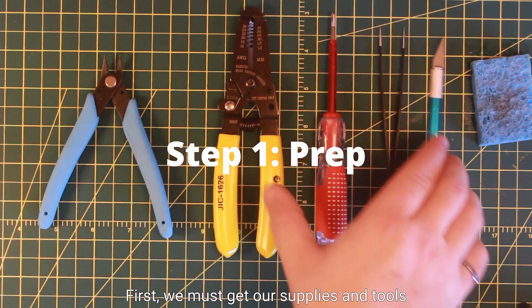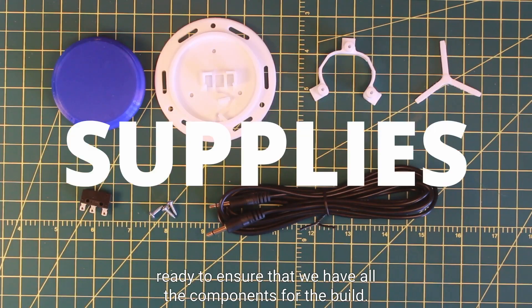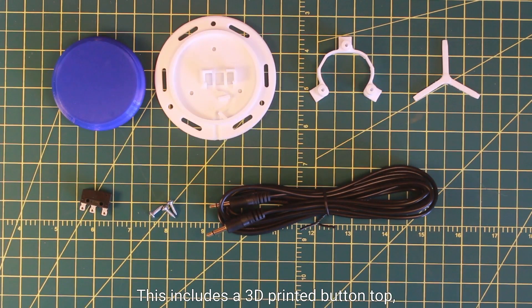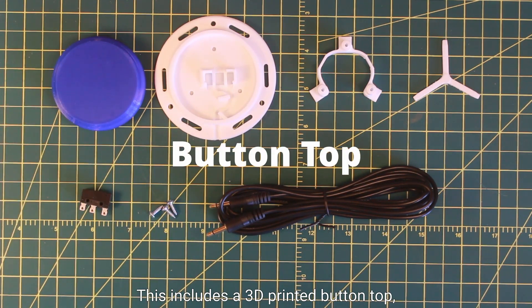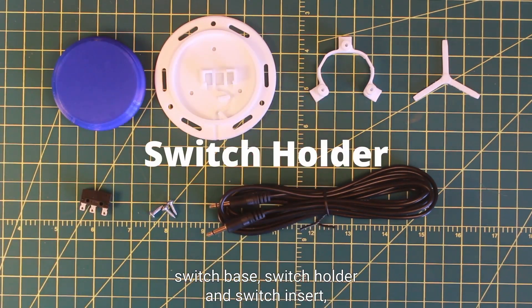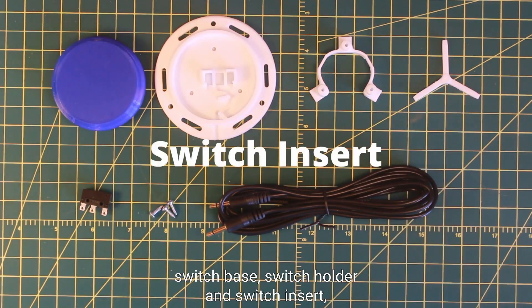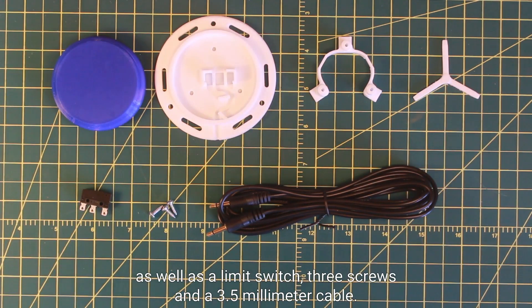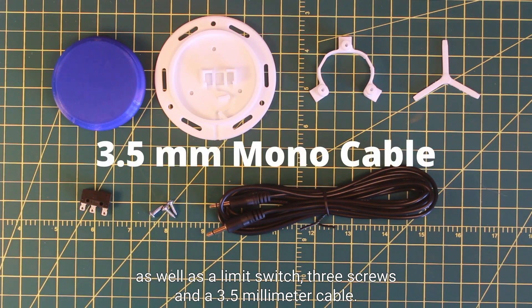First we must get our supplies and tools ready to ensure that we have all the components for the build. This includes a 3D printed button top, switch base, switch holder, and switch insert, as well as a limit switch, three screws, and a 3.5 millimeter cable.